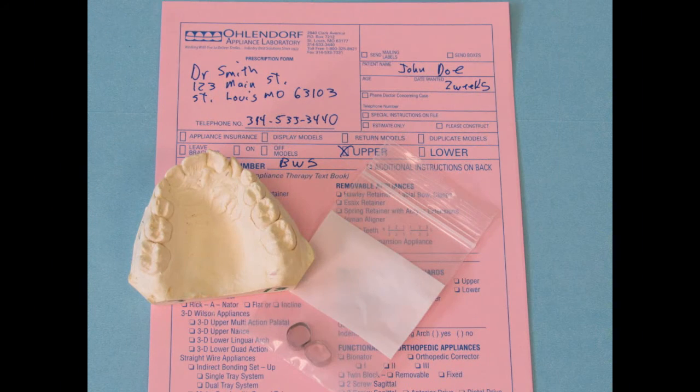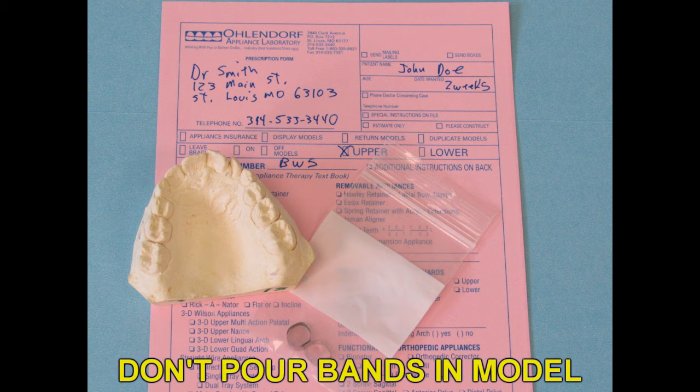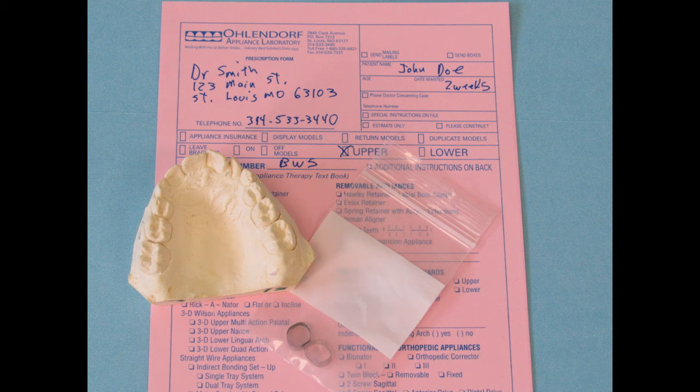In order for us to fabricate the BWS, we will need a working model for the arch you need the appliance made on. You can send your own bands or we can provide them for you. We prefer that you do not pour up the bands in the model — please send them separately in a plastic bag. We do not need a construction bite or an opposing model. Please let us know if you would like cuspid loops or straight wire buckle tubes, as we will not include them unless you request them.